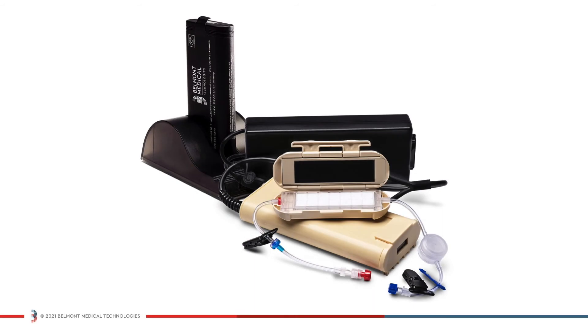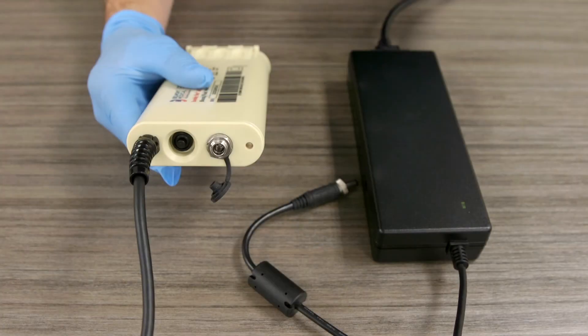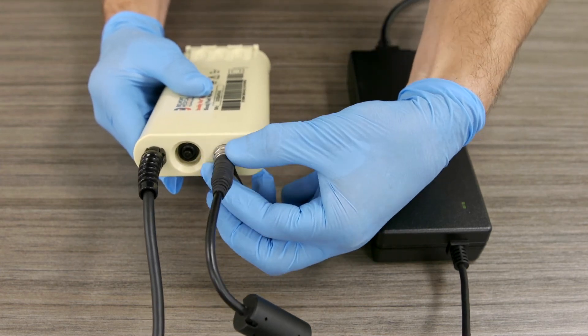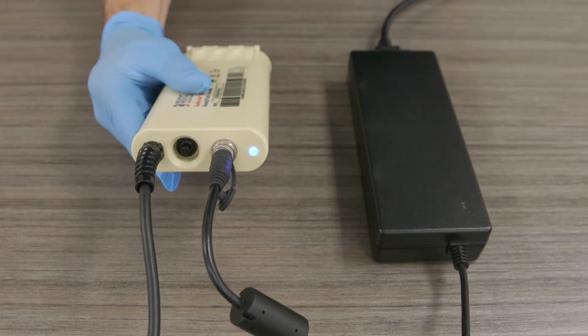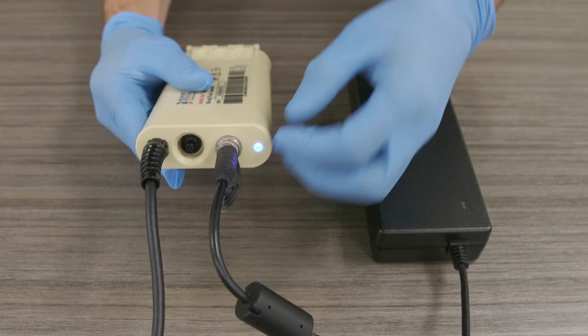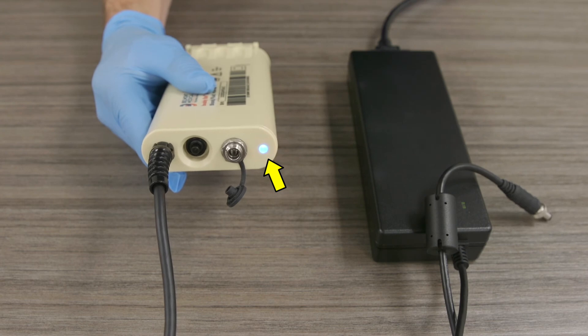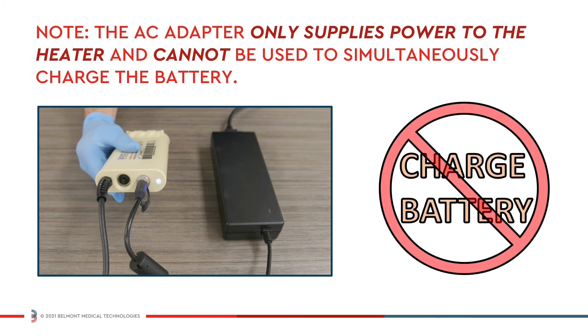The BuddyLite AC is designed for extended use anywhere AC power is available. The internal battery is isolated from the AC power source, conserving battery power and protecting against overcharging. The system can easily switch from AC to battery power, eliminating any interruption in fluid administration. To operate the system on AC power, connect the AC-DC power supply to the AC adapter on the bottom of the battery housing, and then connect the AC-DC power supply to the power source. The on/off switch controls power to the heater unit from either the battery pack or the AC-DC power supply. When the AC-DC is disconnected, power will revert back to normal battery operation. Note: the AC adapter only supplies power to the heater and cannot be used to simultaneously charge the battery.